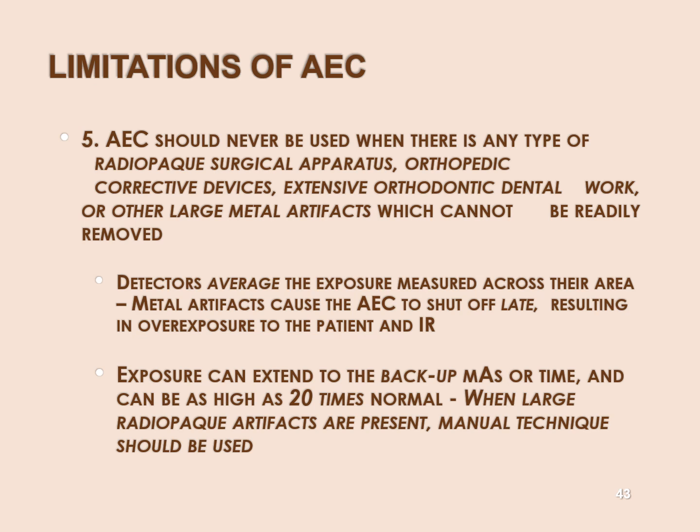If they say that they have an artificial hip, just ask them, assess. Have you had this hip replaced? Turn off the AECs if they have. Okay. Spine fusions, not so much. You can still use AECs on spine fusions. Okay.